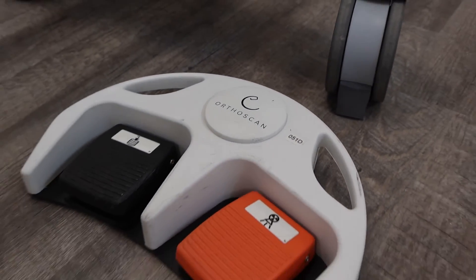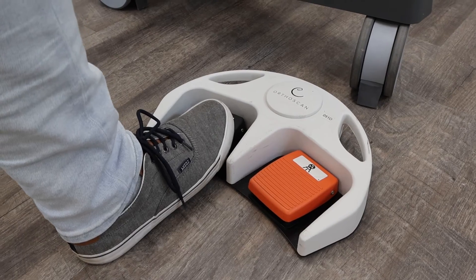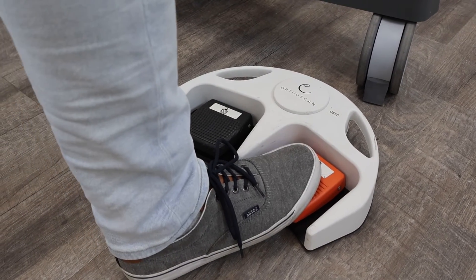This unit comes with a fluoroscopic foot switch that can be wired or wireless, giving the clinician optimal positioning options.